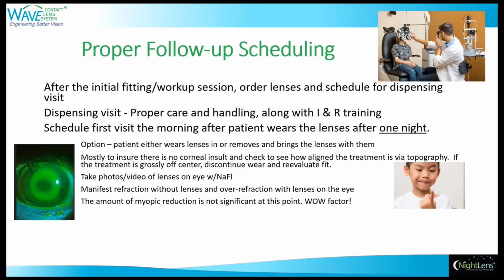But that treatment that morning will start to fade during the day. So as the patient continues to wear the lenses overnight for successive nights, that vision will remain stable longer in the day.